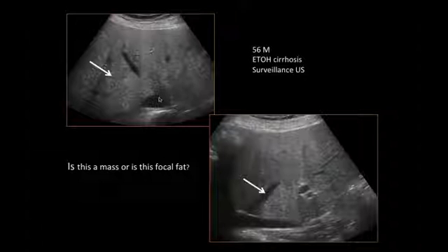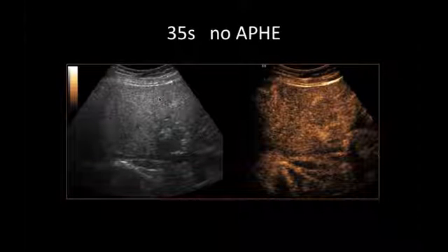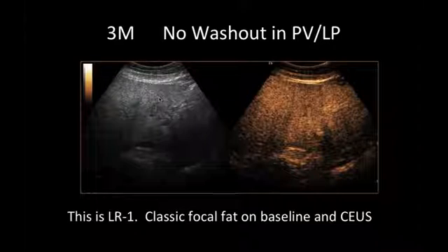So many of the patients who are sent to us from outside surveillance clinics will send patients with a liver that looks like this. So here we can see a liver that's filled with sub-centimeter hypoechoic nodules when we look at the liver with a high-frequency probe. If the liver is uniformly looking like this, it is a more difficult liver for certain, but this would be one where our suspicion would be less because there's not a dominant nodule. In any case, what can we do to look at this patient?